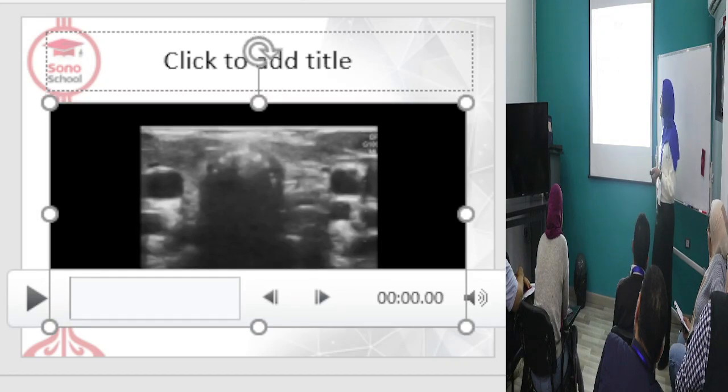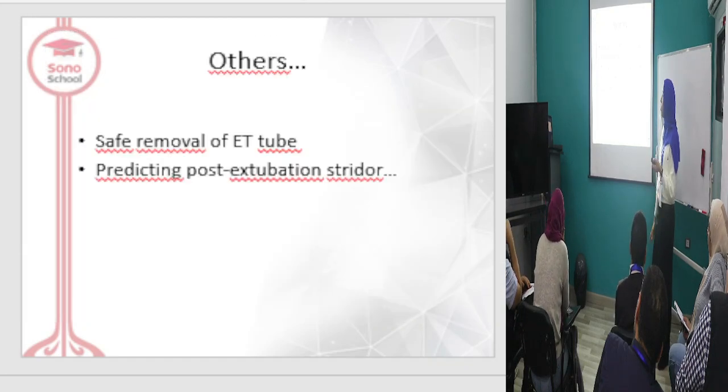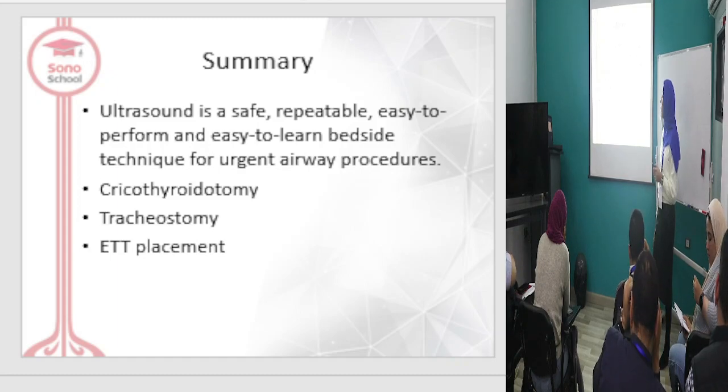You can predict post-extubation stridor due to the presence of edema. Ultrasound is a safe, repeatable, easy to perform and easy to learn bedside technique to do cricothyroidotomy, tracheostomy, or endotracheal tube placement. If wrong, in the esophagus, you can change to trachea. And thank you.